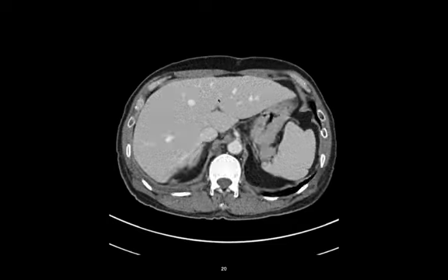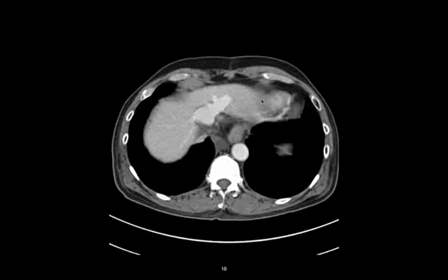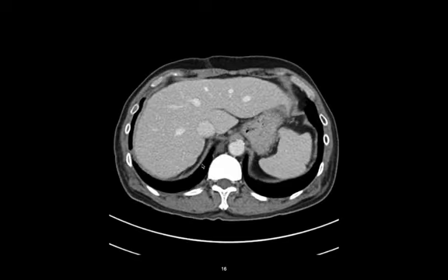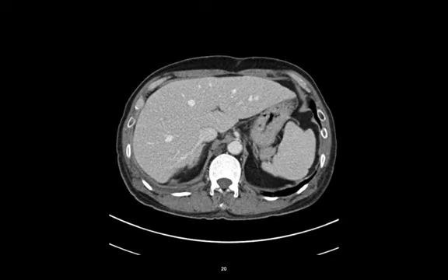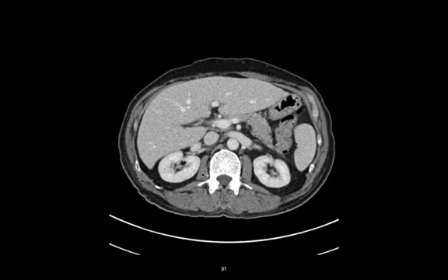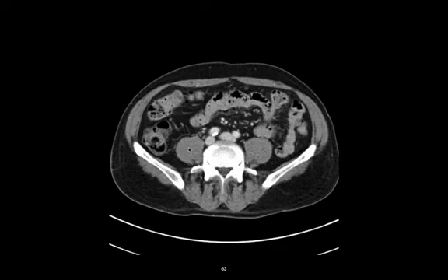Now, the diaphragm and the liver are kind of hard to tell apart because they're both the same grayness. We come down, that is diaphragm right there, but we're getting into the liver as well. So what I do is I follow this muscle out right there, and there's the right and left crura of the diaphragm. Then we're going to see this psoas major muscle right here get bigger and bigger as I'm going down.